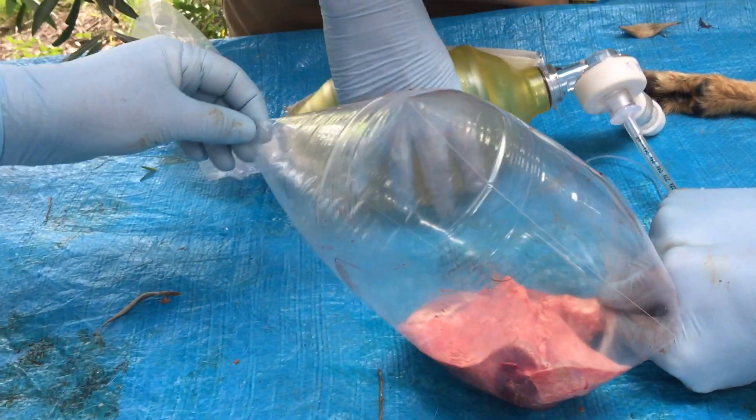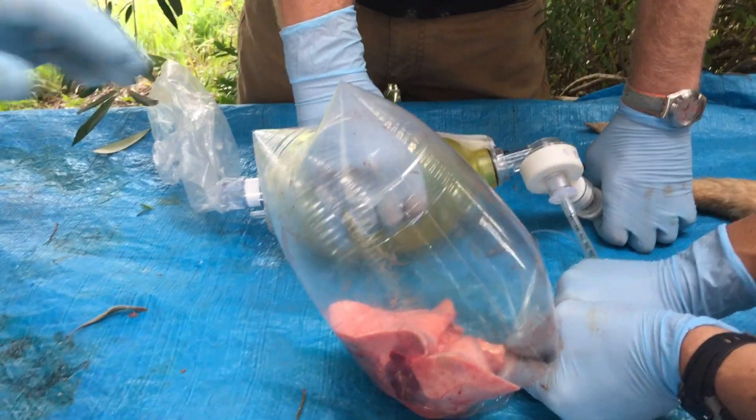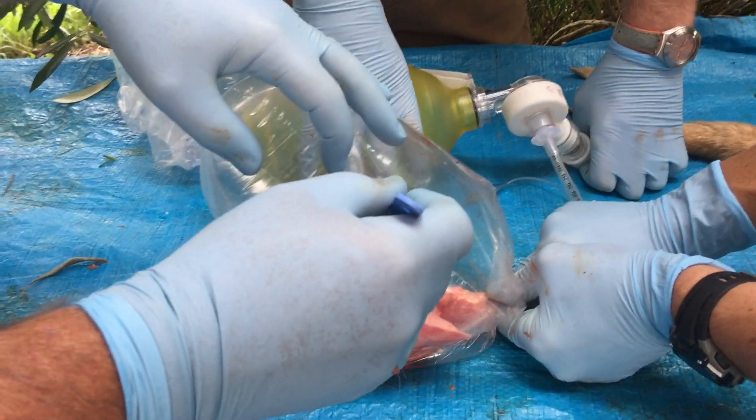Do you need a needle decompression or a finger thoracotomy? Let's do a finger thoracotomy on this bag and see if we can relieve some pressure.